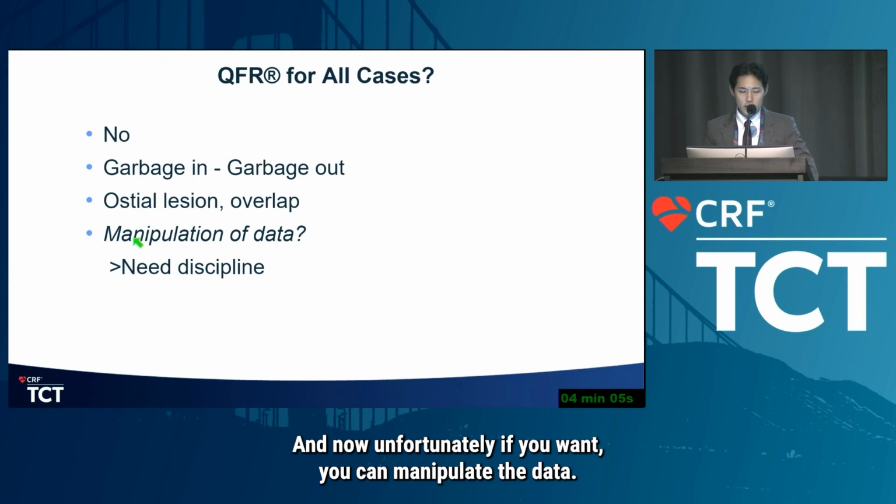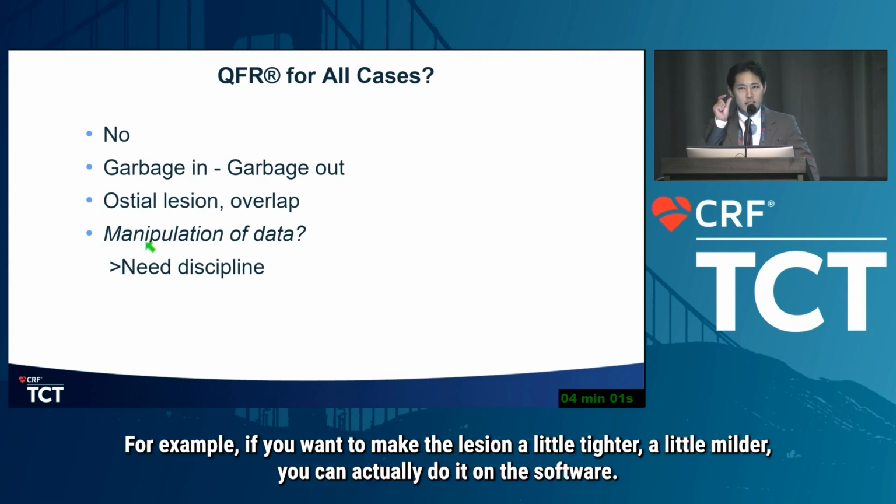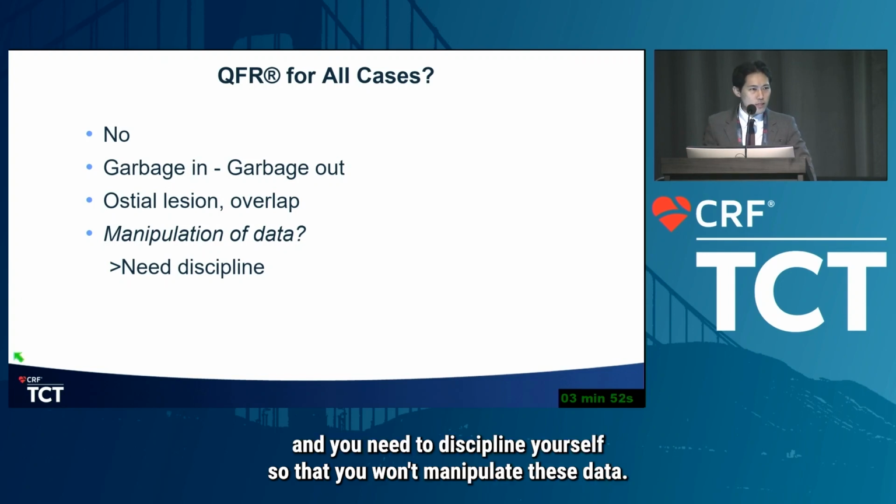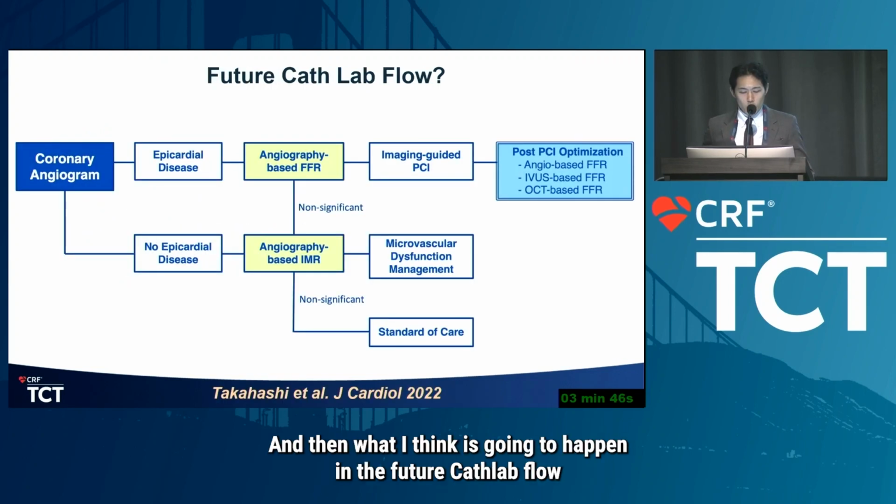And unfortunately, if you want, you can manipulate the data. For example, if you want to make the lesion look a little tighter or a little milder, you can actually do it in the software. So you need to go through all the training, and you need to discipline yourself so that you won't manipulate these data. And then, what I think is going to happen in the future cath lab flow.